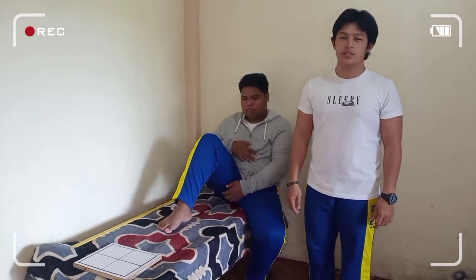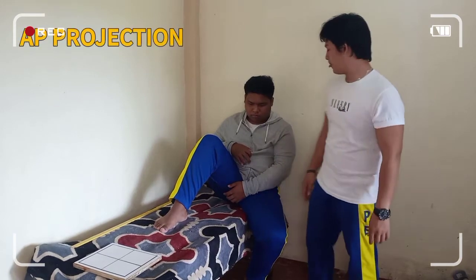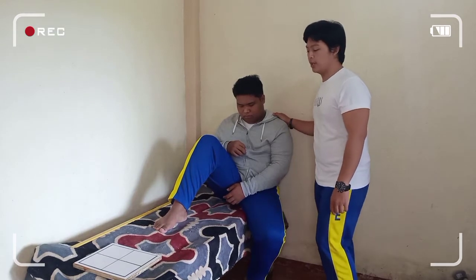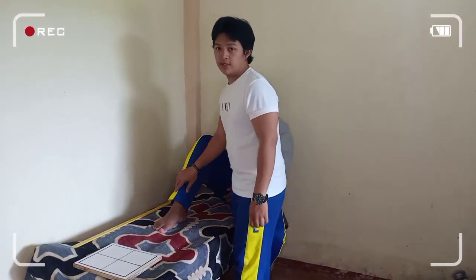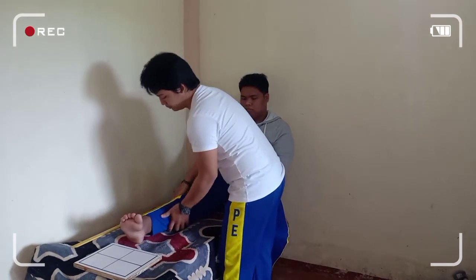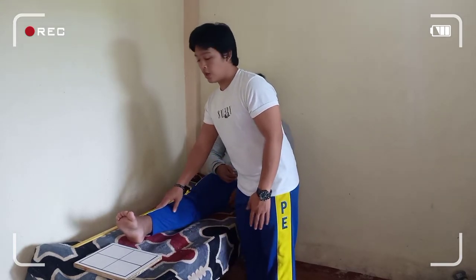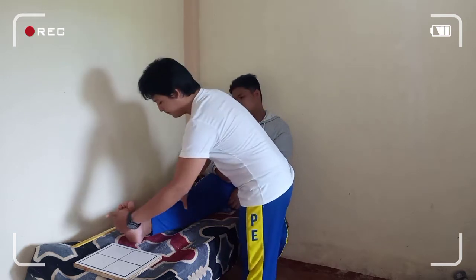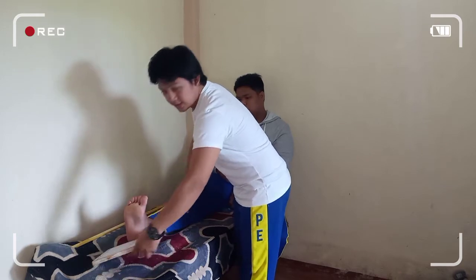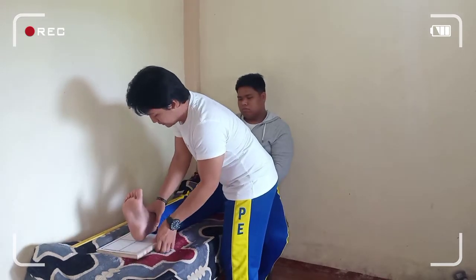Today, we will be discussing different projections of the ankle. The first projection is the AP projection. First, have the patient seated or in supine position on the radiographic table, and the affected limb must be fully extended. Place the ankle joint in anatomic position with the foot facing upward, and place the image receptor to the ankle.